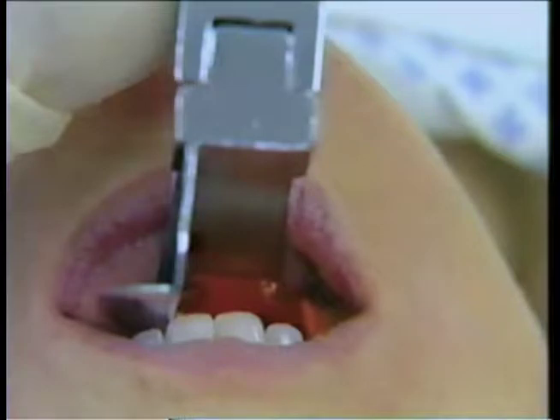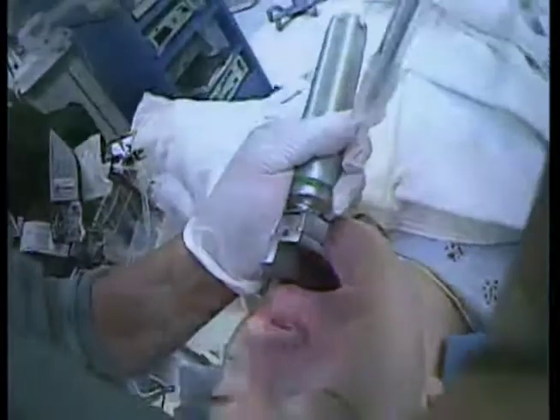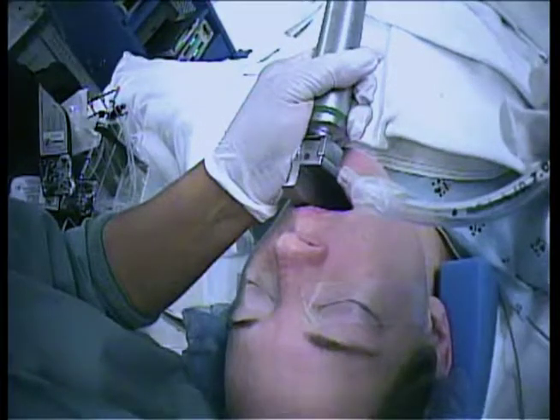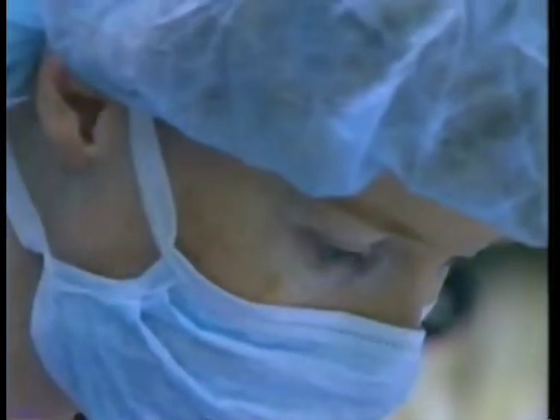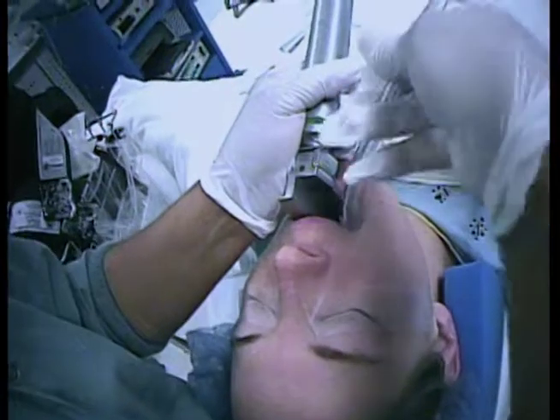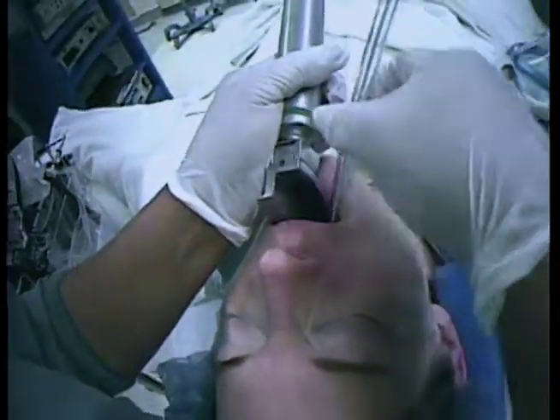The head is now suspended from the laryngoscope in the left hand. Pick up the tube with your right hand — you can also ask your assistant to hand it to you in the correct orientation for insertion. You should keep your eyes on the trachea. Hold the preselected tube in your right hand like a pencil, curve forward. Pass the tube to the right of the blade into the larynx through the cords.